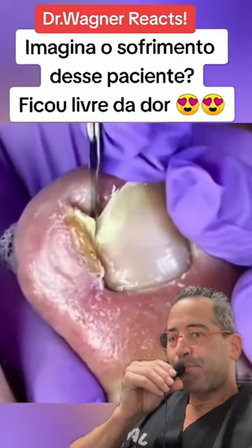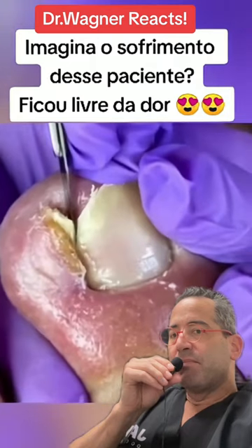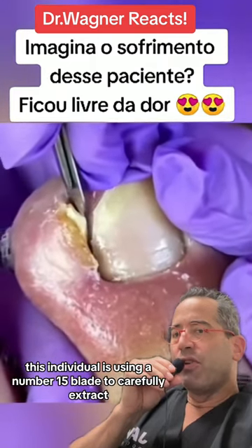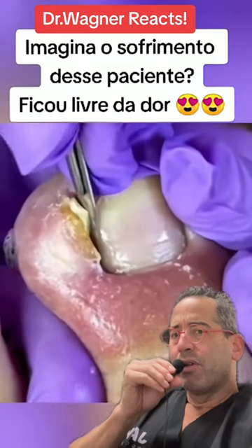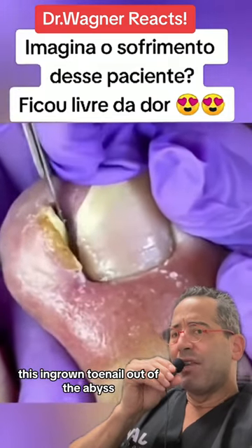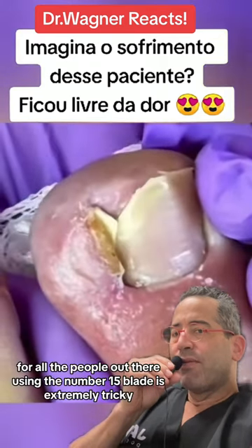Okay, let's see what we got here. This is a monster paronychia, chronic in nature until proven otherwise. This individual is using a number 15 blade to carefully extract this ingrown toenail out of the abyss. For all the people out there, using the number 15 blade is extremely tricky.